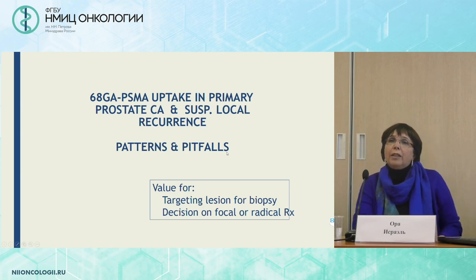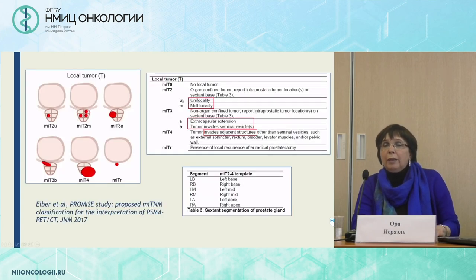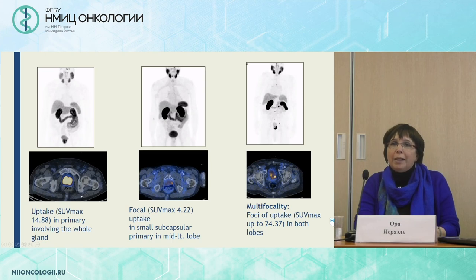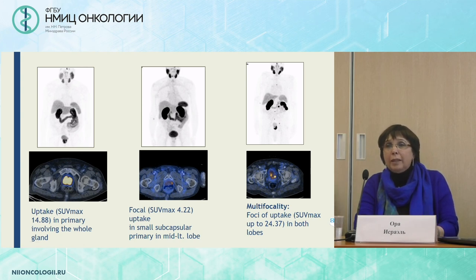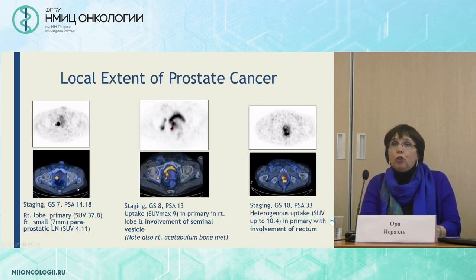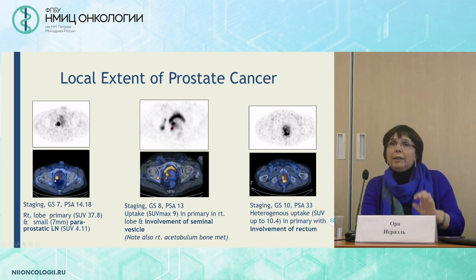So let's now look at various scenarios and patterns. When we look at the local tumor, everybody who works with prostate cancer knows T-staging. A few examples of PSMA uptake in the primary tumor: this is very high uptake in a large tumor involving the entire gland; this is uptake in a small, not so high-intensity lesion in a small subcapsular primary in the mid-left lobe; and this is a multifocal tumor with prostate cancer located in both lobes. We can also use PSMA PET-CT to look at the local extent of prostate cancer.